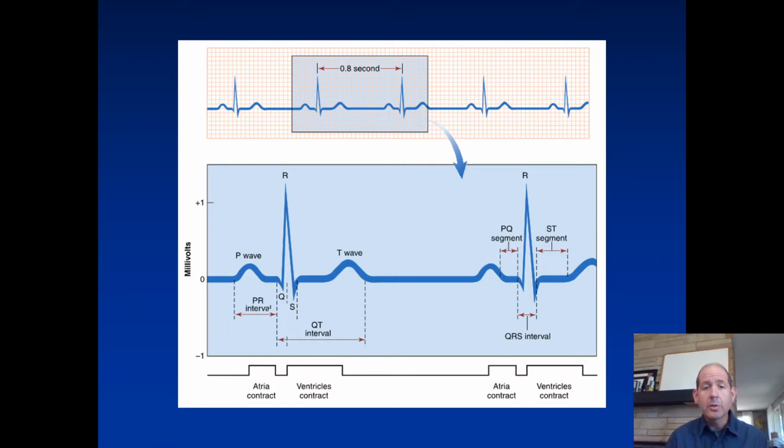So how can you distinguish between a bundle branch block and a PVC, a premature ventricular contraction, which is an example of an ectopic focus? Well, first, PVCs usually are going to occur isolated, so it's not going to be every beat, whereas a bundle branch block would be occurring continuously. PVCs can come in runs, so that's not always something you can count on, but if an impulse starts at the ventricles, you would not expect to see what before the QRS complex?